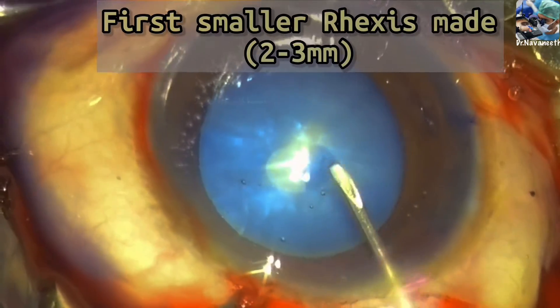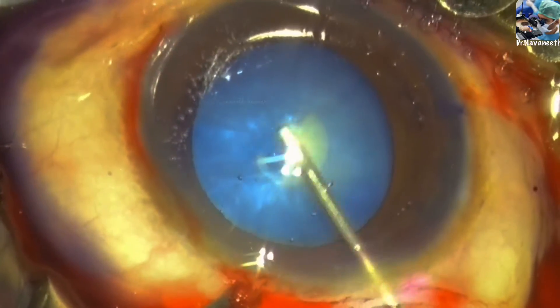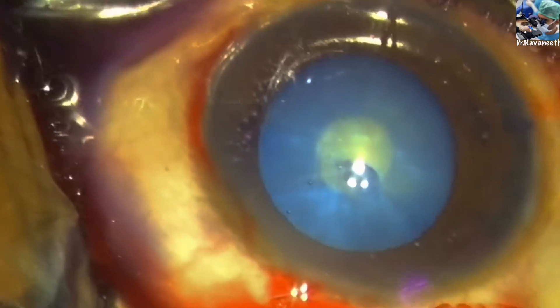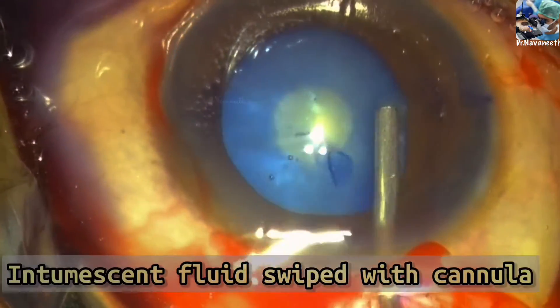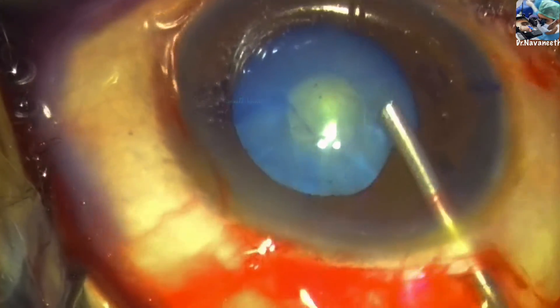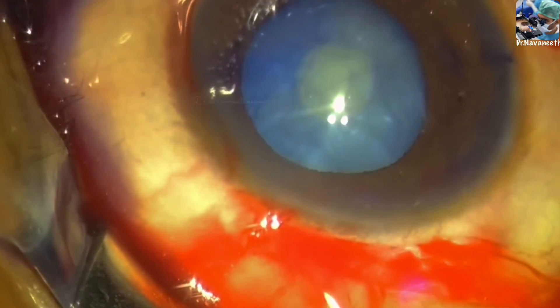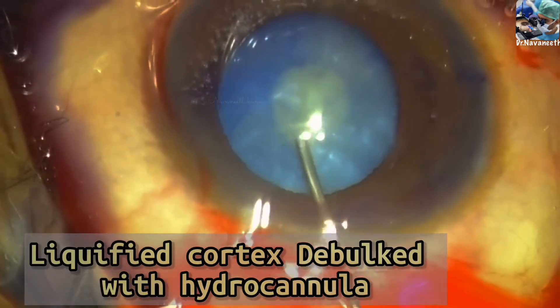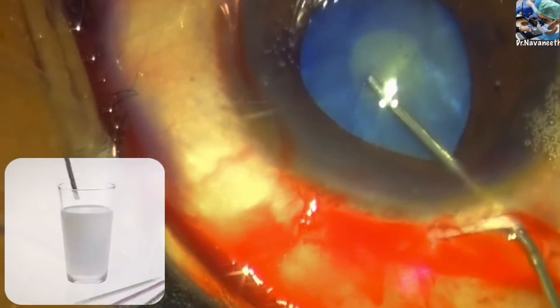First, a small-sized rhexis of around 2 to 3 mm is made. Liquefied cortex is then milked into the capsulotomy opening by gentle swipes with a viscocannula, followed by aspiration of the liquefied cortex with a hydrocannula all around from the back.